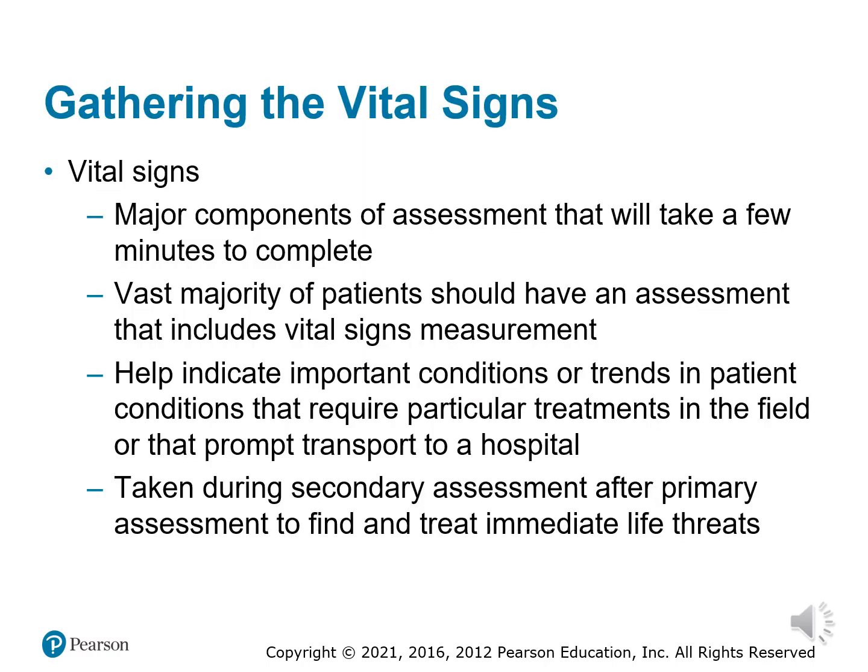Okay, gathering vital signs. It is a major component of assessment that will take a few minutes to complete. The vast majority of patients should have an assessment that includes vital sign measurements. It helps to indicate important conditions or trends in patient conditions that require particular treatments in the field or that prompt transport to the hospital. It's taken during the secondary assessment, after the primary assessment to find and treat immediate life threats.